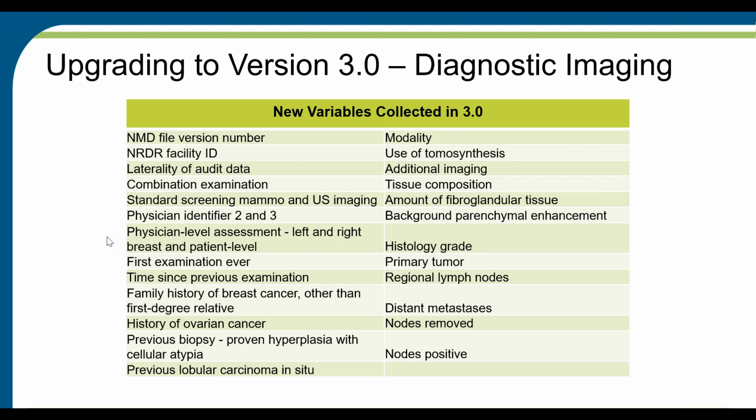So technology changes and the questions we want to answer change, and the questions that a facility would want to know are changing. The biggest conceptual change in version 3 from version 2 is we're including all the modalities. So instead of focusing primarily on just the screening mammogram and mammography, this includes ultrasound, breast MRI, and inherently screening breast ultrasound, and new technologies such as tomosynthesis.